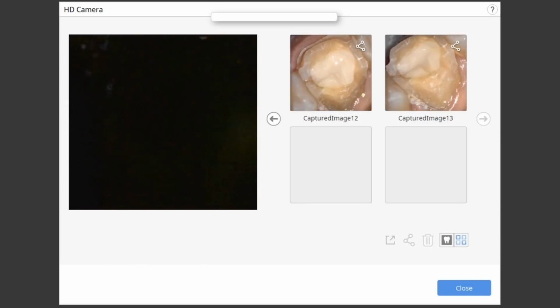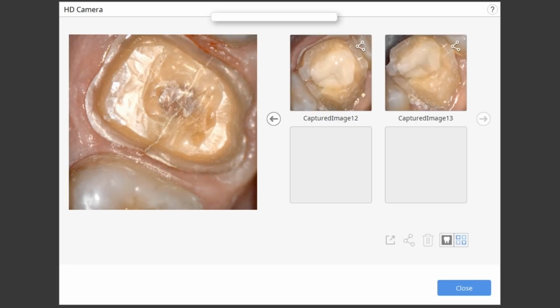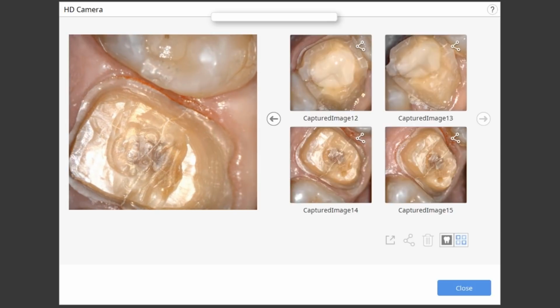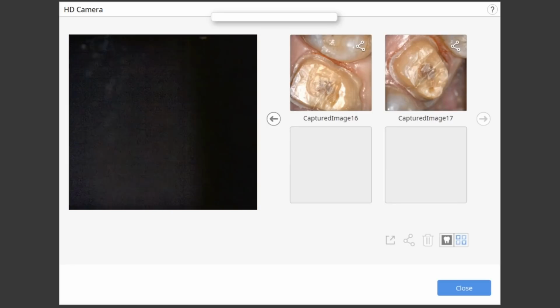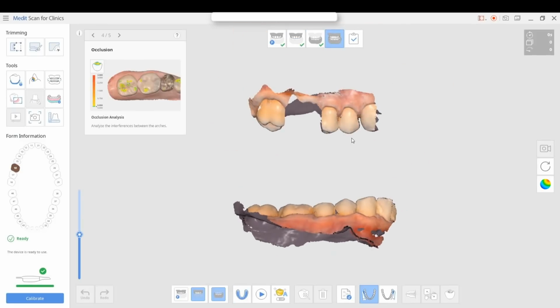So next we'll reduce the facial walls, the interproximal, and then ultimately we've got almost the final prep here. You can clearly see the crack line that extends from the mesial to the distal, right across the occlusal surface. Now, the clinical decision was made to actually place a restoration on this tooth and give it a fighting chance and see how the patient responds. So it's great to document that crack for the patient. We have no idea how it's going to respond over time, but it's a worthwhile effort to restore this tooth permanently, give it a good fighting chance to retain its vitality and maintain its function in the patient's mouth.